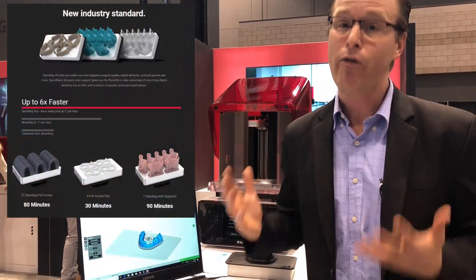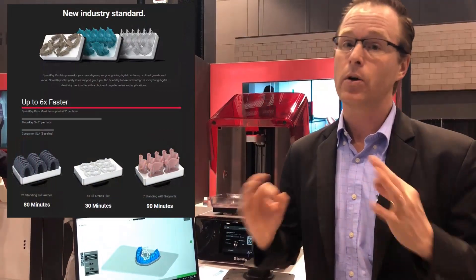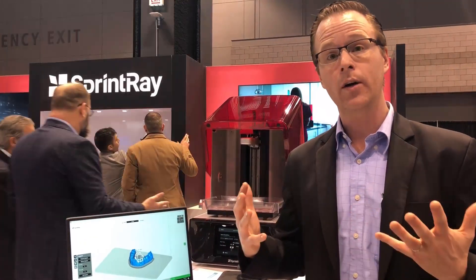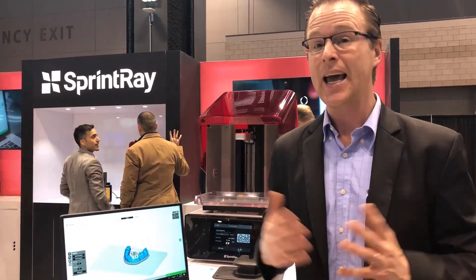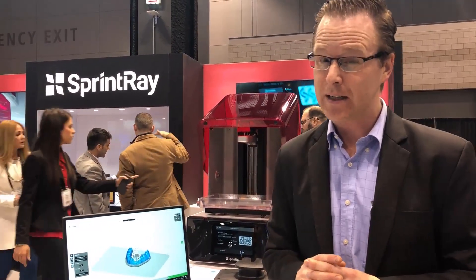The neat part about this is how fast it is and how clean the prints are. The current estimate is a surgical guide in 10 to 15 minutes, and a dental model in 25 to 30 minutes.